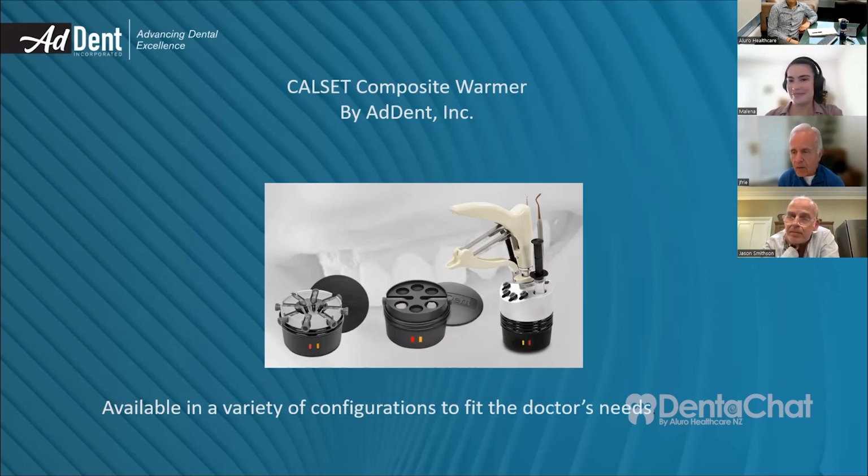The 68 degrees C didn't come about from science. It just came about because we made the first units for the University of Oregon with 68, and everybody in the industry has used that number. So to answer the question, we probably need some more research, both from a safety point of view and from a materials point of view, to see if a higher number would give us some improvements. Fair enough. There you go.